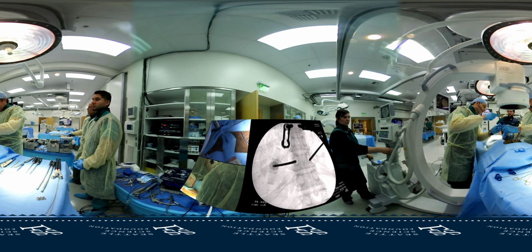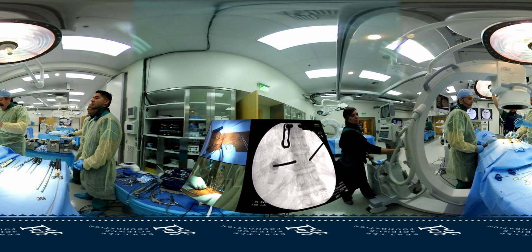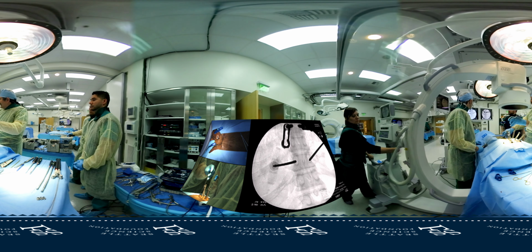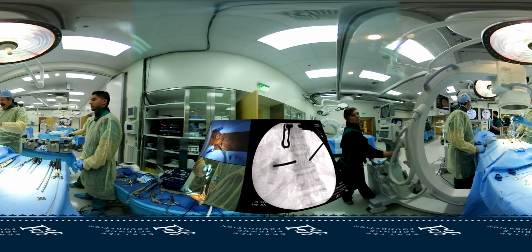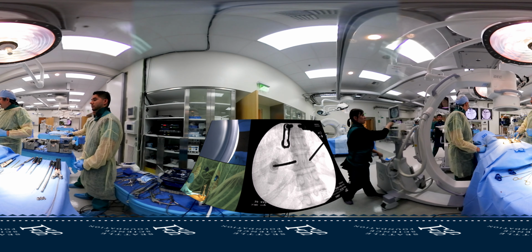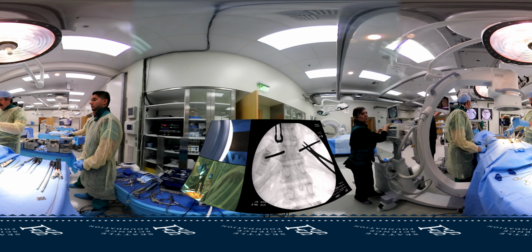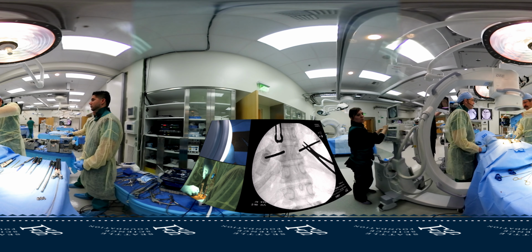Can you step back a little bit on the video? Okay. Yeah. And so mine, if you look at, I'm a little concerned about the one on my side because I'm already into the middle of the body and I've barely gone in. So I'm going to make an adjustment. Picture. And how big are those K-wires? How much adjustment? This is just a Jamshidi needle so far. So how many millimeters is that? 2 millimeters? Probably 2 to 3.